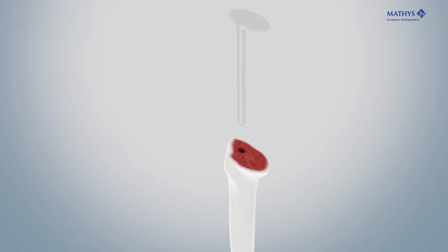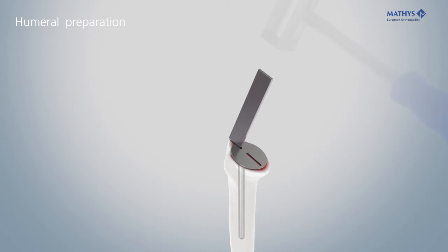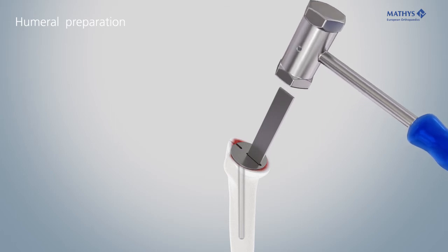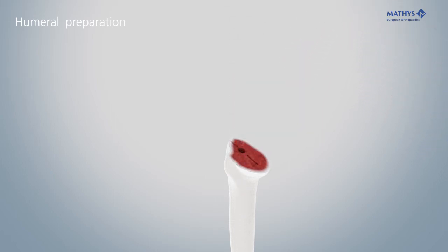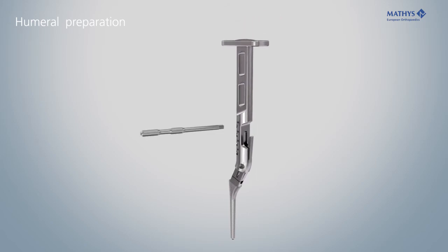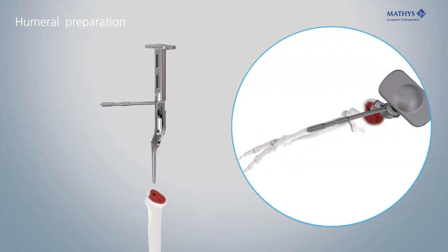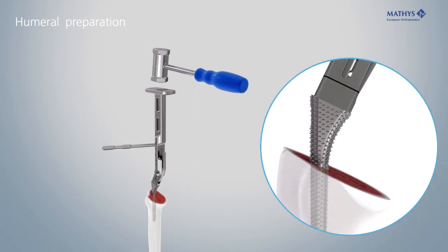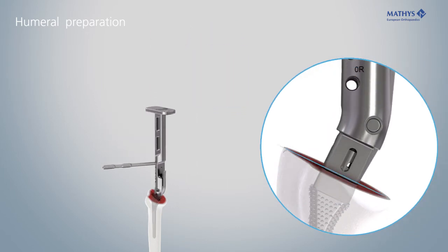Insert the retrotorsion guide and use the lateral and medial slots to mark the correct alignment of the rasp. Lock the rasp firmly in the positioner. Screw the alignment rod into the hole corresponding to the desired retroversion and align it parallel with the forearm. Gradually rasp open the medullary cavity. The correct depth has been reached when the laser marking on the positioner is in line with the resection plane.